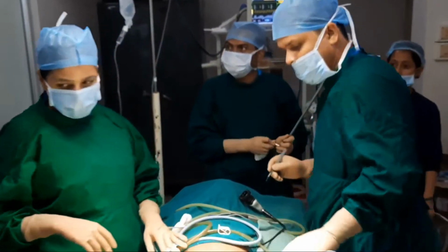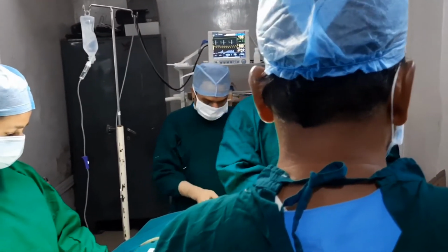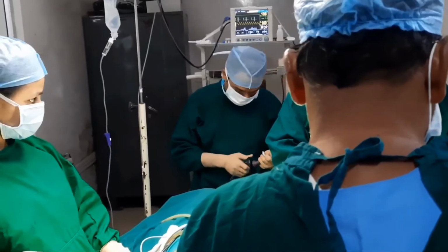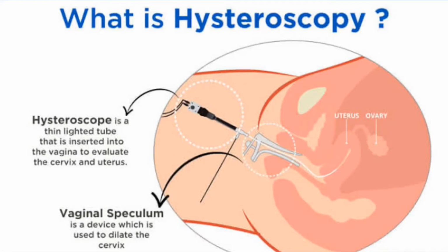Now, for example, if you want to evaluate a case with hysteroscopy and laparoscopy, you have to know what things can be evaluated by laparoscopy, and what things can be diagnosed and managed by hysteroscopy. So if you have hysteroscopy as well as laparoscopy in a single setting, then many things can be evaluated in an infertile couple, particularly the female partner.